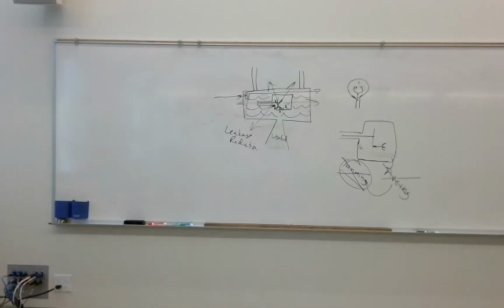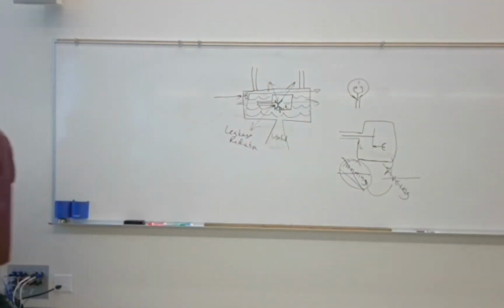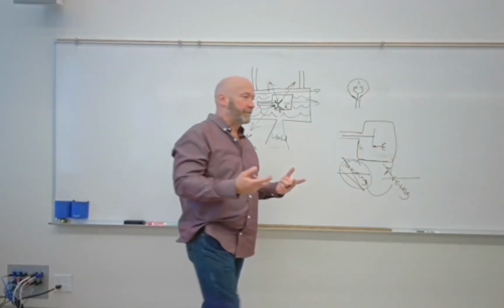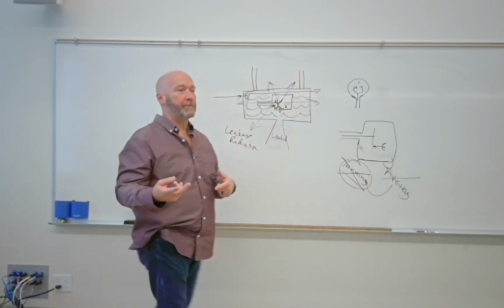If all of that stuff the X-ray beam has to go through before it gets to the patient is the equivalent of 2.5 millimeters of aluminum in its density, then you're good. You can make an exposure. But if it doesn't, then we have to have more filtration added to it. So we have two different types of filtration. This is kind of getting out of order for the lecture, but we have two different types of filtration.